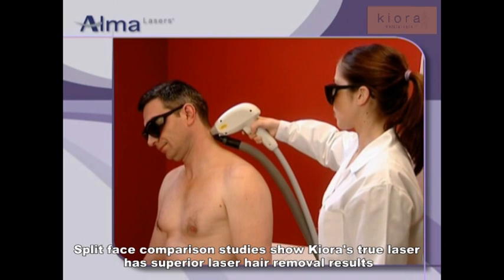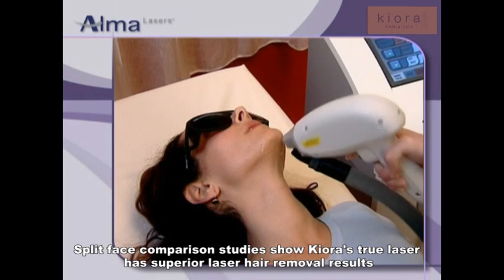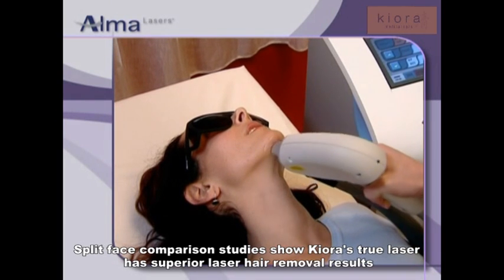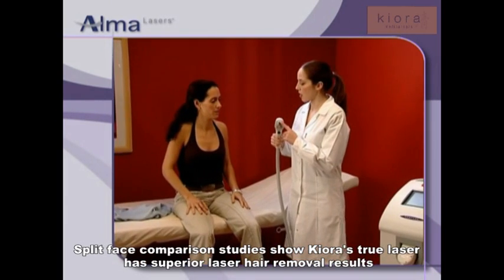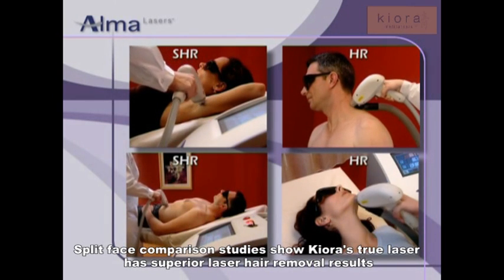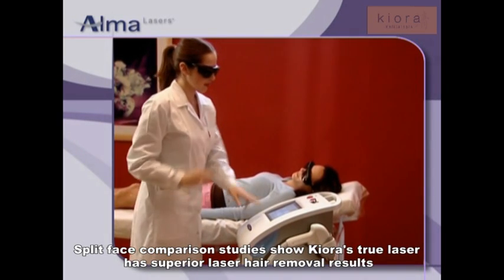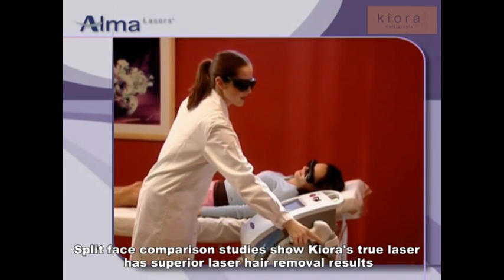The Soprano XL also includes the traditional Higher Fluence Hair Removal Mode. The Soprano system is cleared for all skin types, including tanned skin. In this video, we will demonstrate the system operation and treatment procedures for both Soprano XL modes. First, let's see how the Soprano XL system works.